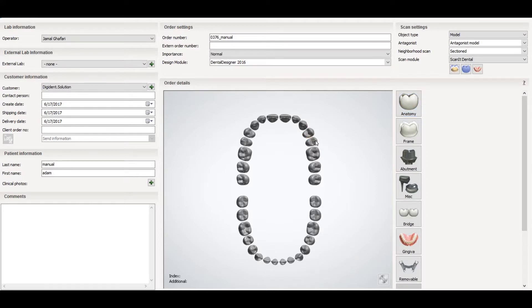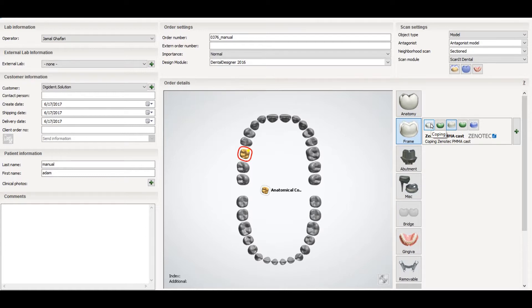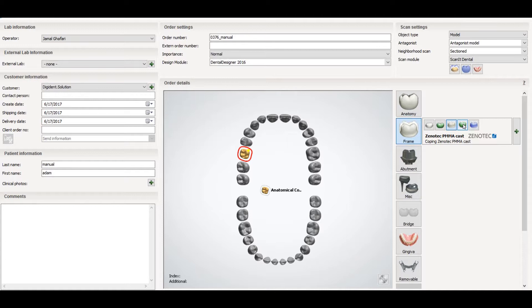Now let's talk about milling a natural coping. Select the tooth you want to make a coping for and go to the second option on the right side called frame. The first option is for simple coping, the second is for a normal pontic, and the third is for natural coping. If you want to make a natural coping or facial cutback, select the anatomical coping option. For facial cutback on the pontic, select the anatomical pontic option. The last option is for the backup scanning.